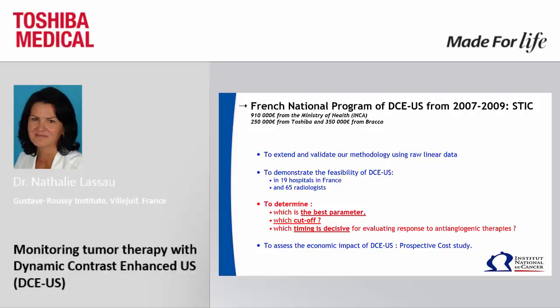participate in order to determine which is the best parameter, probably the area under the curve, but also which is the best timing, which is the cutoff. Remember, for the RECIST evaluation, this is a decrease of 30%, and also the timing and the cost.